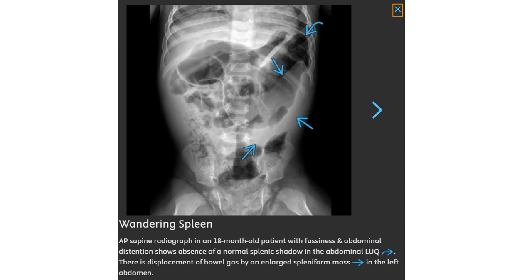This is an AP radiograph in an 18-month-old patient with abdominal distension, showing absence of the normal splenic shadow in the left upper quadrant. This is displaced by an enlarged splenic-form mass in the left abdomen.